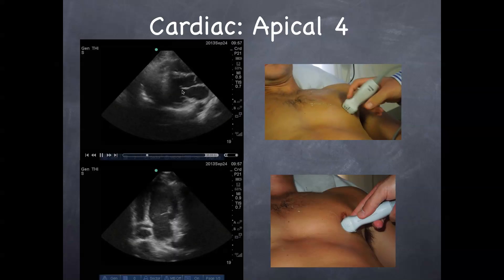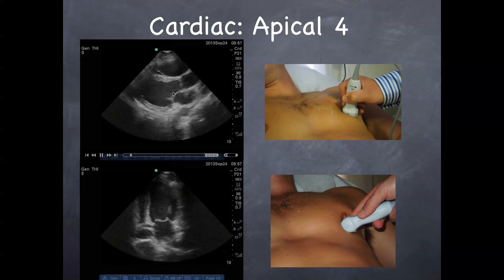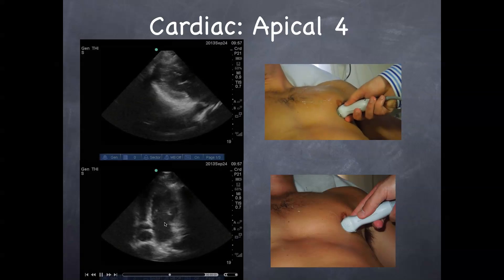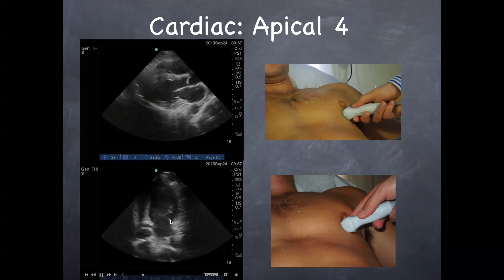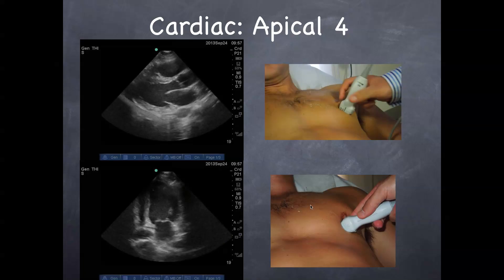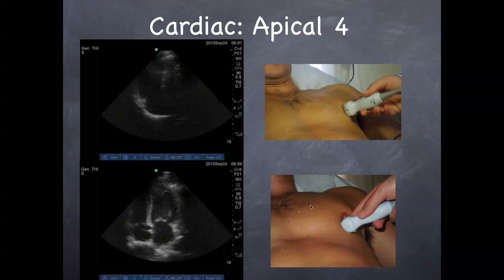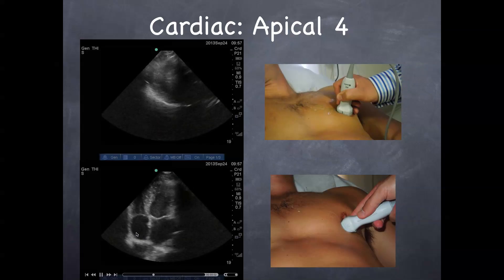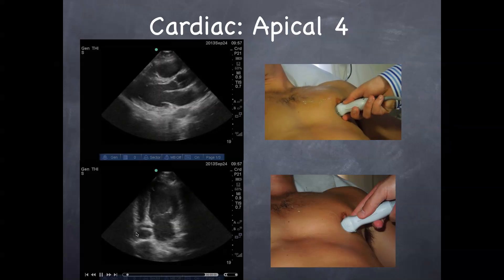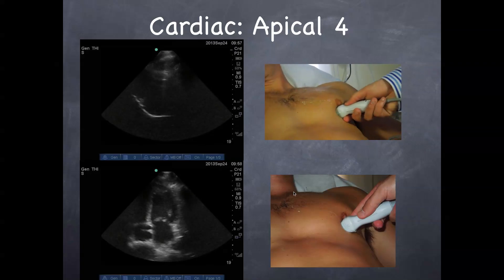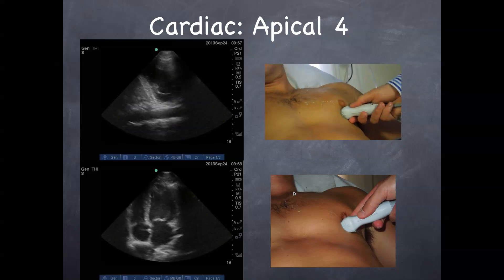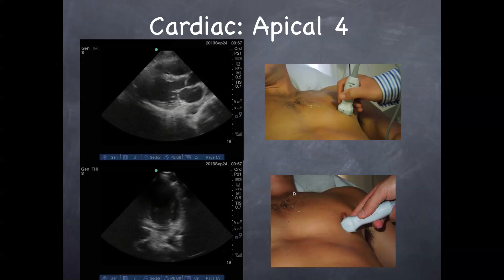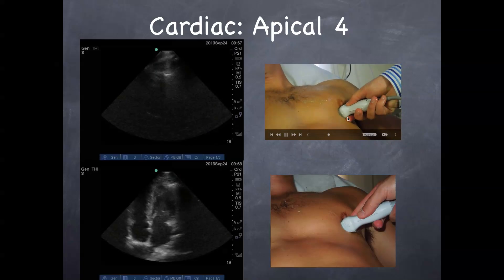Here's your apical four-chamber. The way I get this is I go from a long axis view, then move my probe right underneath the nipple and point it to the right of the patient — that will generally give you this nice view of the heart. The goal is to get both valves — the mitral valve and the tricuspid valve — in view. It looks like a four-square game. You'll have both ventricles and both atria in your view. Tricks include moving the patient's left arm above their head and having them roll slightly to the left, which brings the heart closer to the surface.